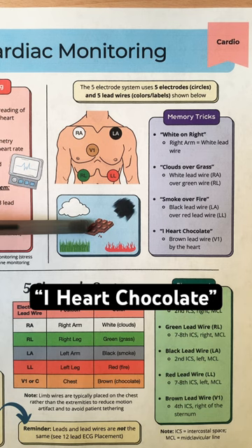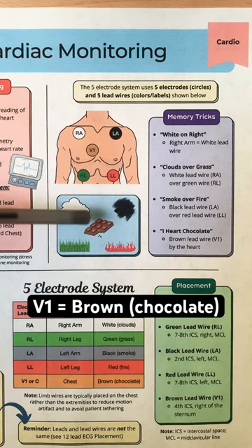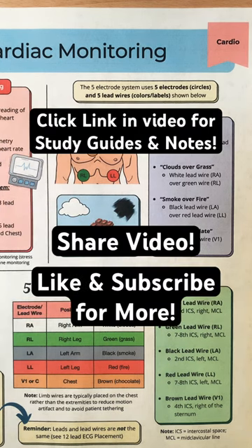Then remember: I heart chocolate. The brown lead wire, which represents chocolate, is V1. It connects to the electrode placed in the 4th intercostal space, right of the sternum.